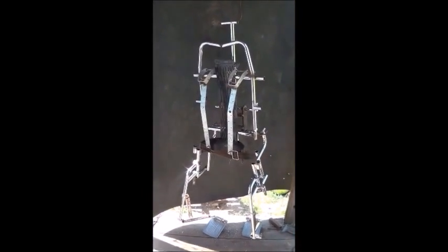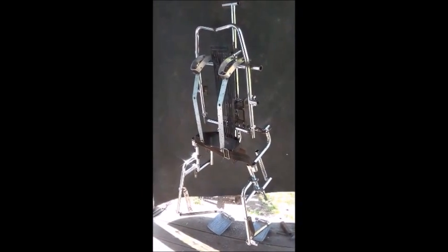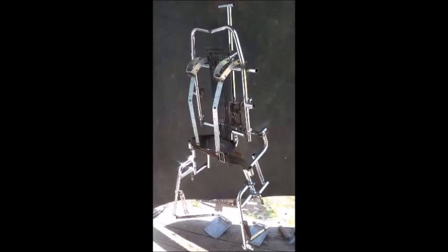Hi folks, Mr. Teslonian here. Today I'm going to show you how I turned a wheelchair into a wearable exoskeleton suit.